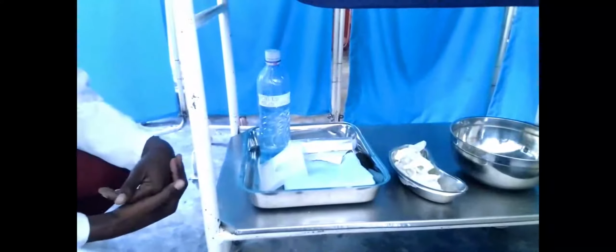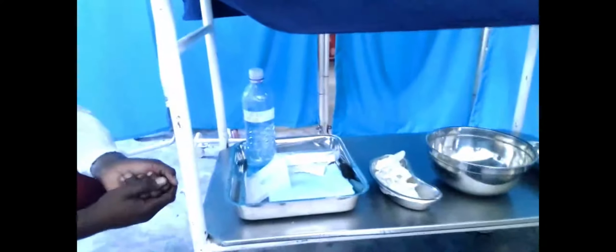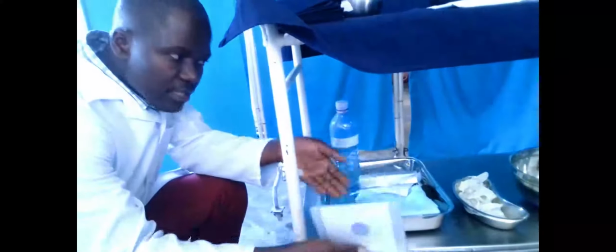Then we come to the bottom shelf. On the bottom shelf, we have cool boiled water. This is the solution that we're going to use to clean the colostomy. Even at home, if patients are discharged, we advise them to use cool boiled water because it's very expensive to have normal saline at home. So you just tell them to boil water, not to buy normal saline. Then we have a new colostomy bag. It's on the bottom shelf because it is not sterile. After you're done with cleaning, you have to tell the assistant who's nearby to give you the bag so that you check.